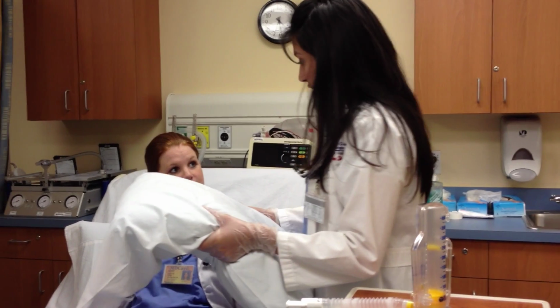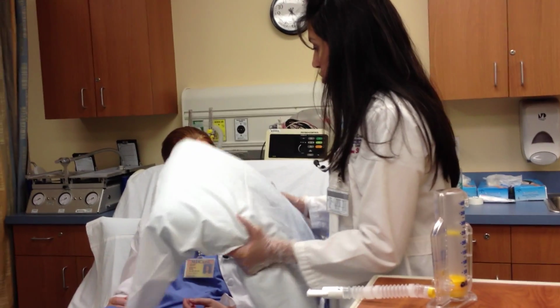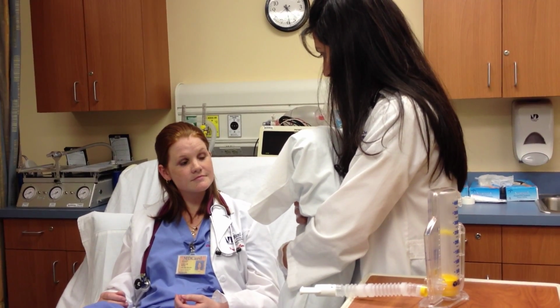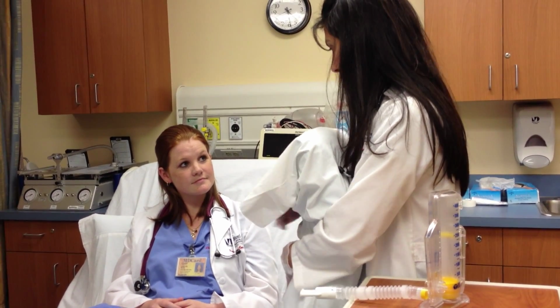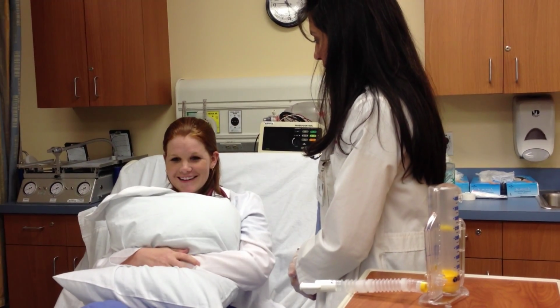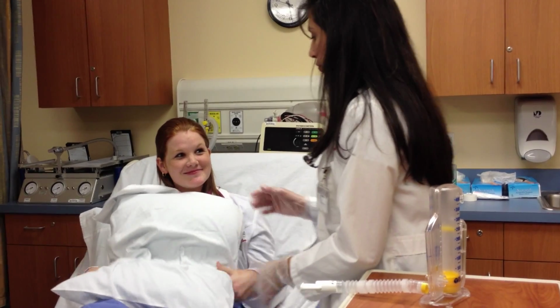Krista, when you're finishing your procedures, you need to cough. So you will press your pillow on your abdominal area and try to cough. This is going to prevent you from feeling pain. Will you try for me? Great job.